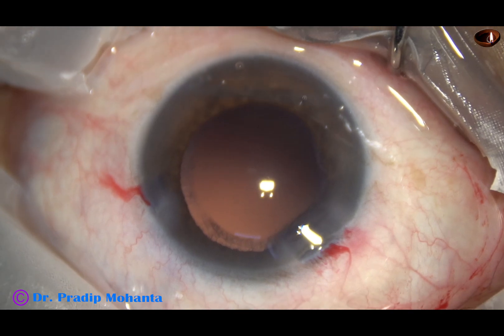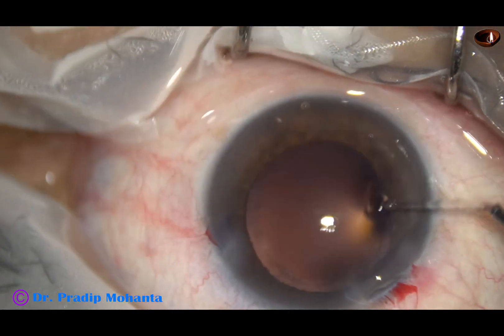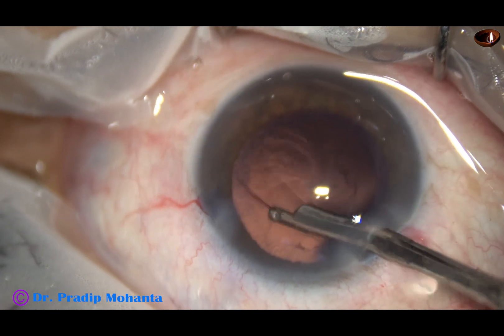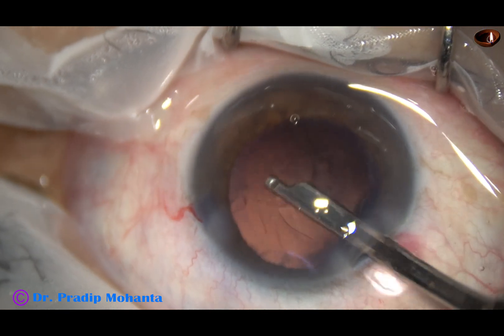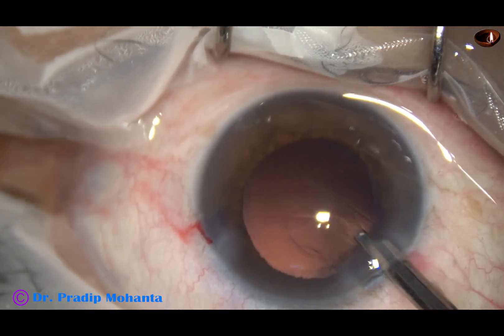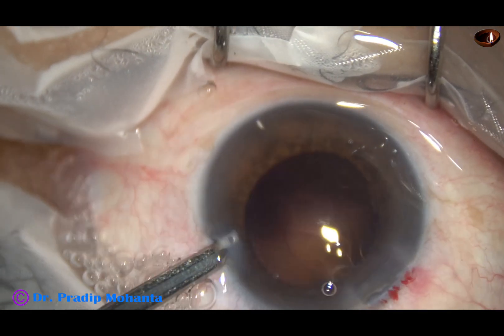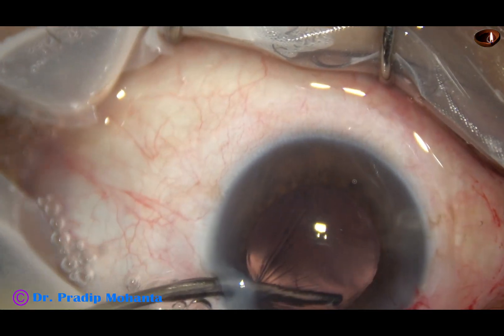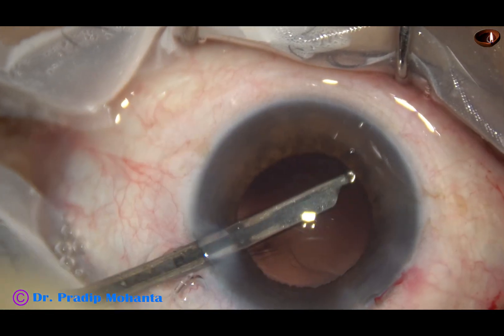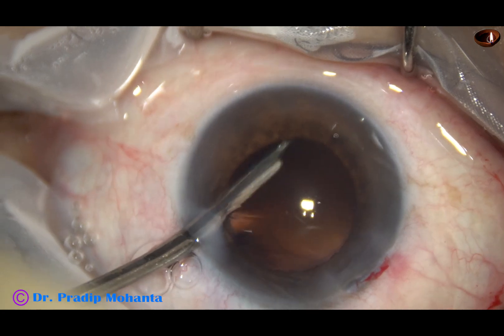And now, this is a 23G Simcoe cannula to remove the cortex. In this case, very little cortex is remaining. Whatever is there is being removed by this instrument. I have made only one side port.